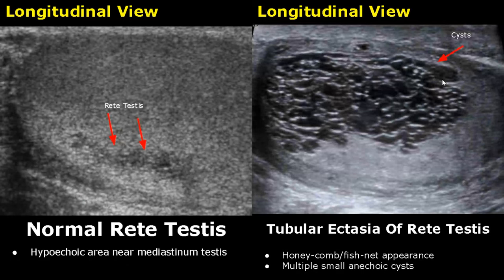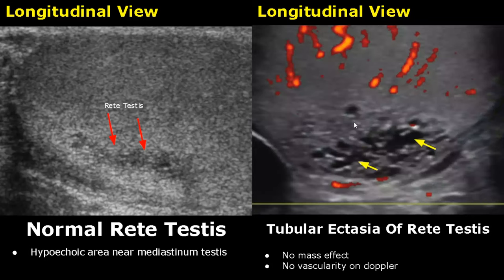In tubular ectasia of the rete testis, there are numerous small anechoic cysts which give a honeycomb or fishnet appearance. There is no internal flow seen with Doppler and there is no mass effect. These features differentiate it from testicular tumors and cancers.